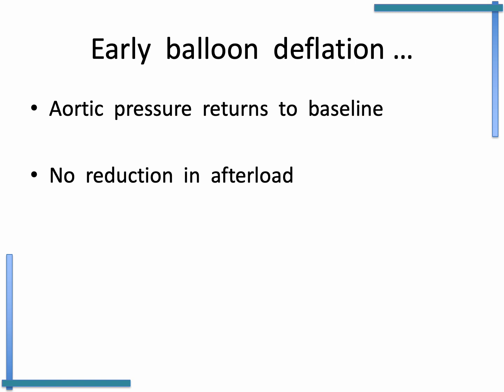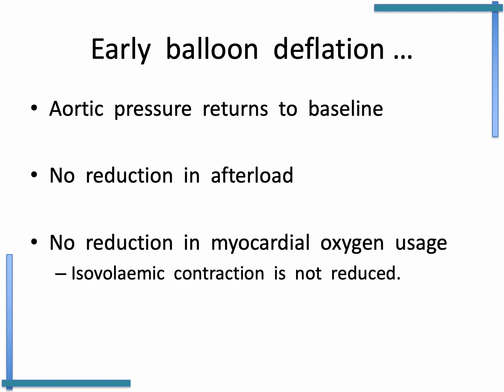And as a consequence, there's no reduction in afterload. And there's no reduction in myocardial oxygen usage, and that's because isovolumic contraction is not reduced. So early balloon deflation is a little bit like late balloon inflation. It's not inherently dangerous or problematic, but it means we're not getting the best out of the balloon pump.